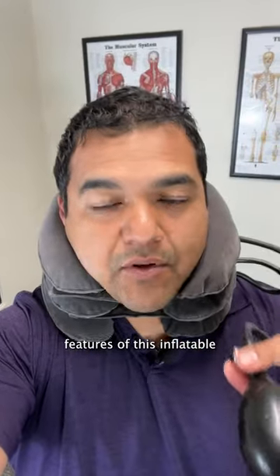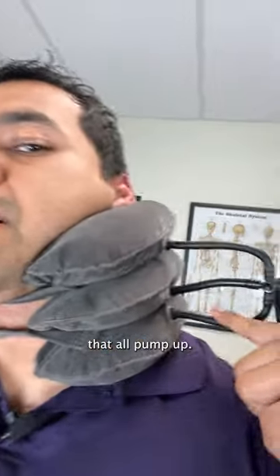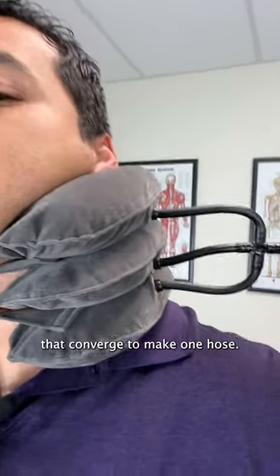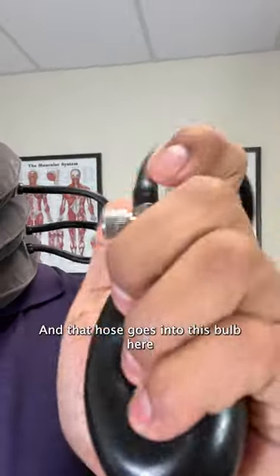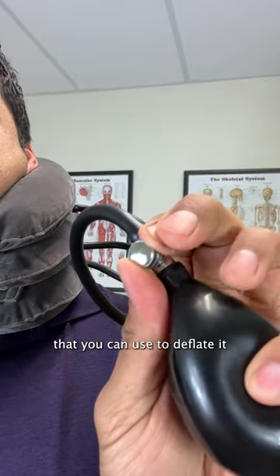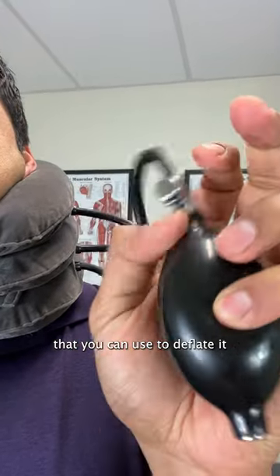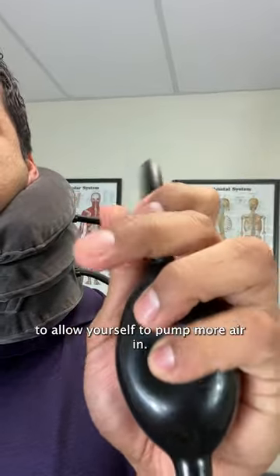Let me tell you about the features of this inflatable neck traction device. It's got three bladders that all pump up. You can see the three hoses right there that converge to make one hose, and that hose goes into this bulb here that you can use to inflate the device. It's got this little valve that you can use to deflate it or lock it to allow yourself to pump more air in.